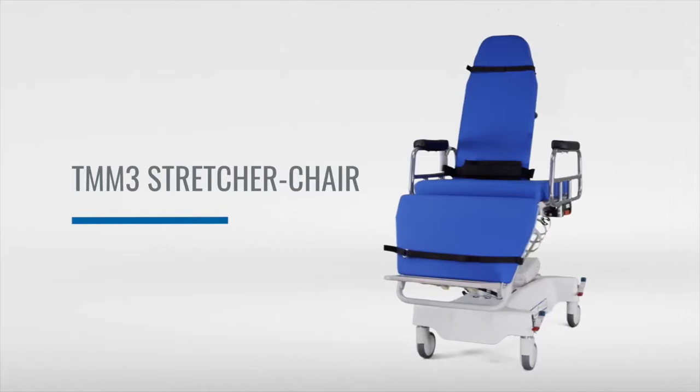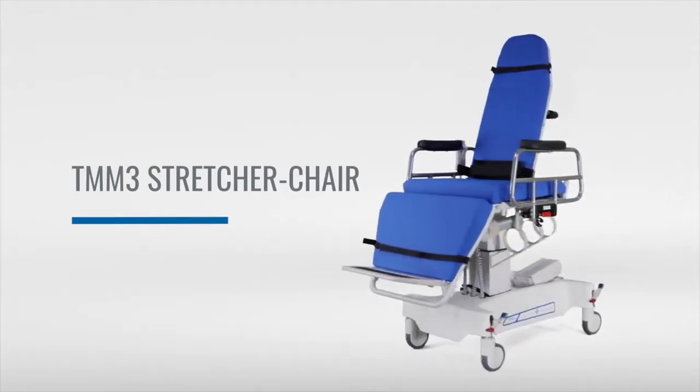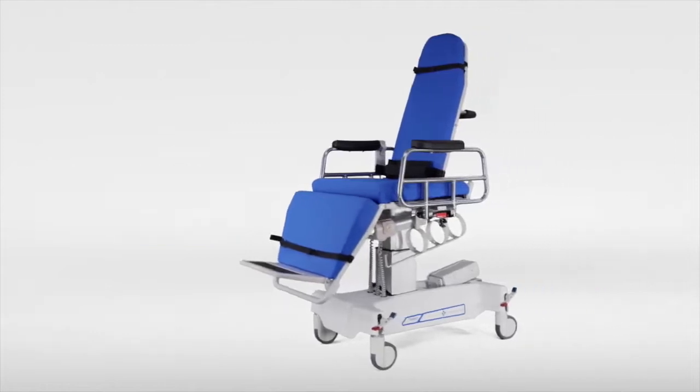Congratulations on the purchase of your TransMotion TMM3 stretcher chair. Let's take a closer look at the TMM3 and safe operation.